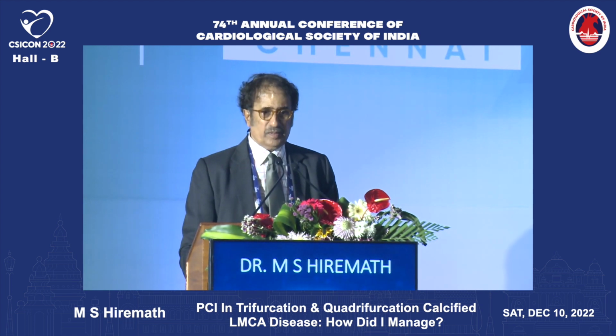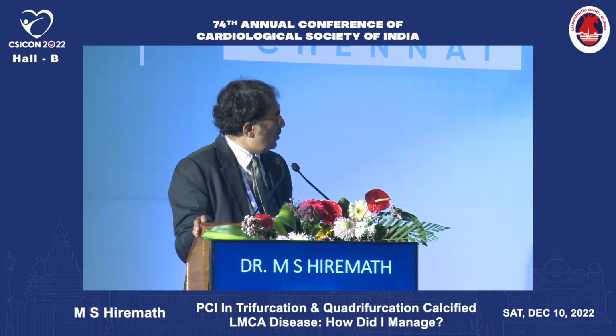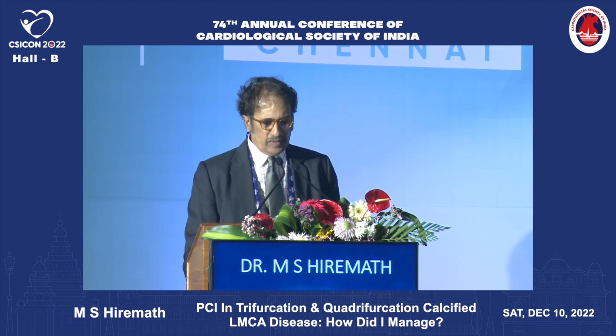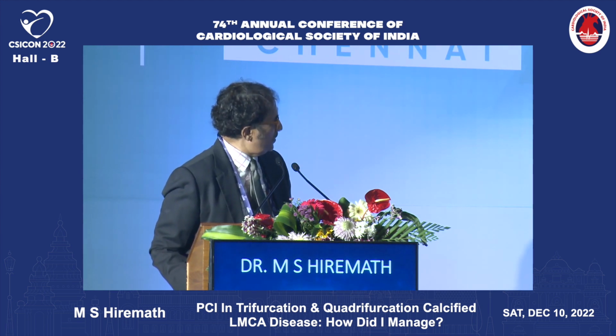This is a similar case. This is not the same case, but again an important lesion at the mouth of the LAD. The OM1 is small and probably has a lesion at the mouth, and this is the circumflex, which is again a big vessel. So here the FFR was negative, 0.93. So we decided that we need not do anything to the circumflex.